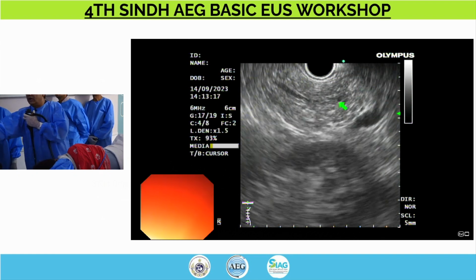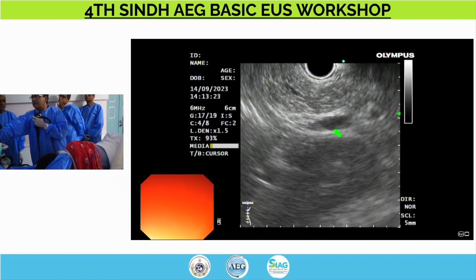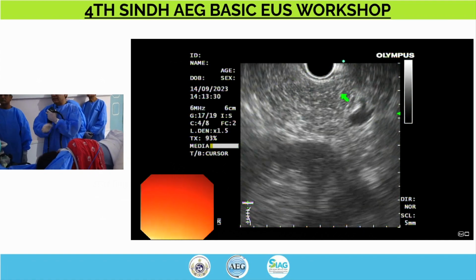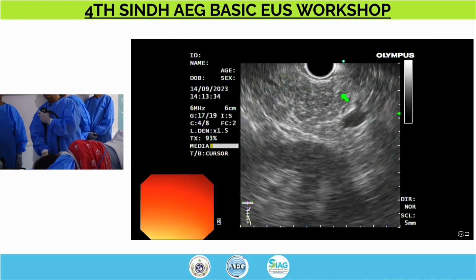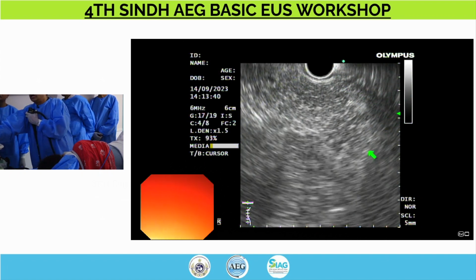It's a little bit longitudinal view, which usually is because my transducer is a little bit crooked there. But you see the left kidney right here, pulling the scope back a little bit gently. And it's a very gentle movement. That's what I'm doing. Here, rotating to the right, and you can see the pancreas right here. Tail is falling down.